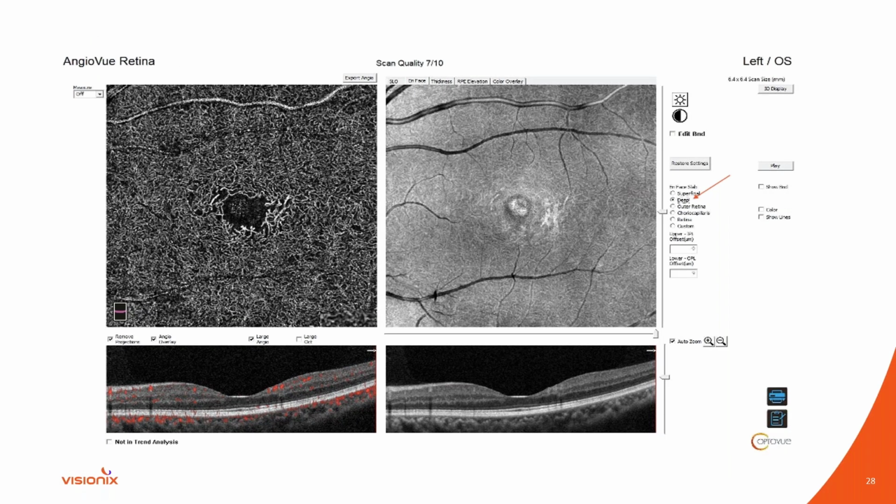So the recap of this is that if I didn't have good technology, whether it be the camera or the OCT angiography, I probably would have dismissed this patient and said, okay, you're doing really well, A1C is great, we'll see you in a year. The problem is that this is going to lead to what I showed you at the beginning of this presentation: one year later, what if?